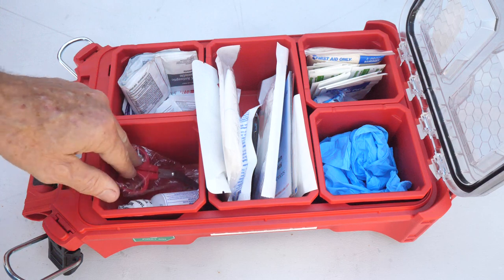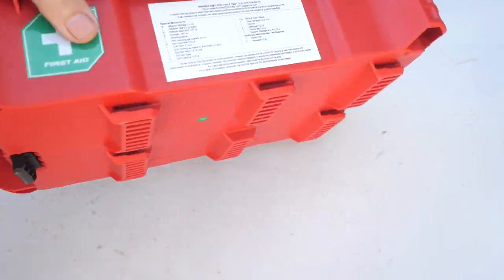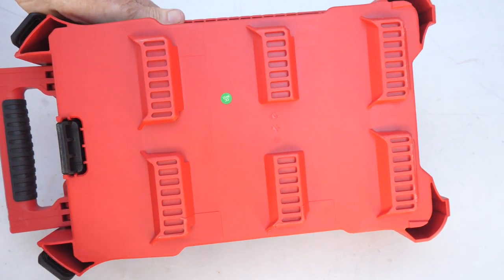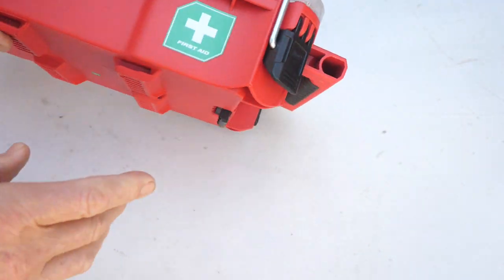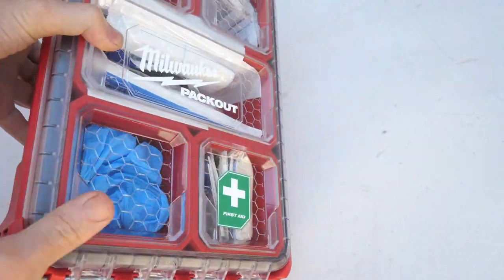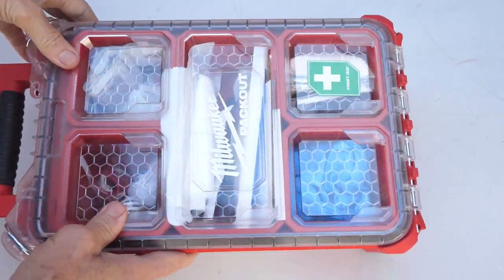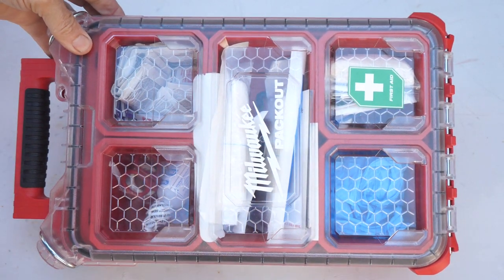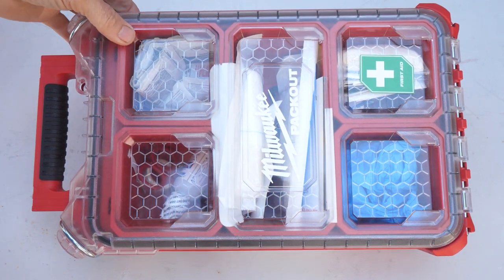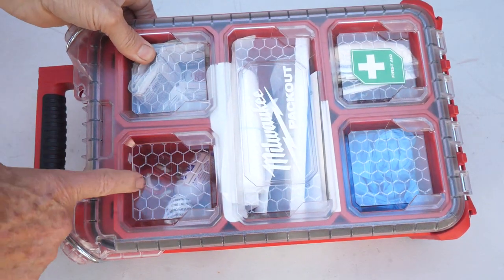Even the little scissors to cut the tape with — it's quite thoughtful. Once you close it up, it's IP65 rated, has a nice handle for carrying, and there's a list right on the case of all the items inside. It fits right onto your Packout stack no problem and it's clearly labeled 'First Aid Kit,' so if you send someone to your van to get it they'll find it easily. There you go — the Milwaukee Packout 76-piece first aid kit. I really recommend this; stuff happens on job sites and this can really come in handy.